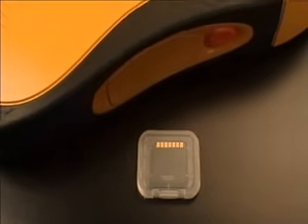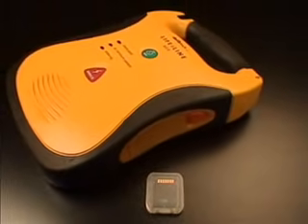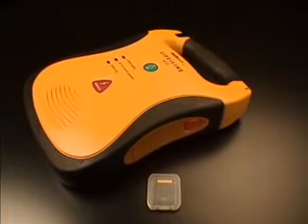The optional data card is used to store extended amounts of ECG data and, optionally, audio data for later review. Note that the Lifeline will store critical ECG data internally, even if no data card is installed.